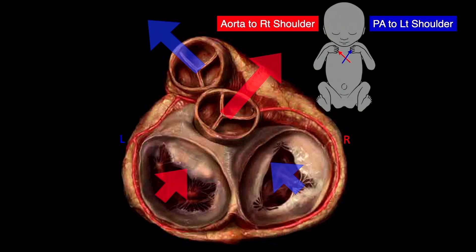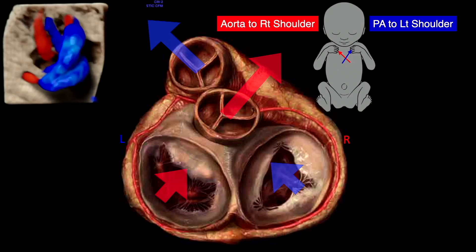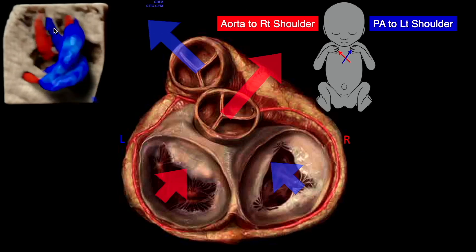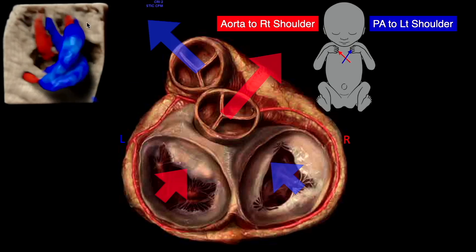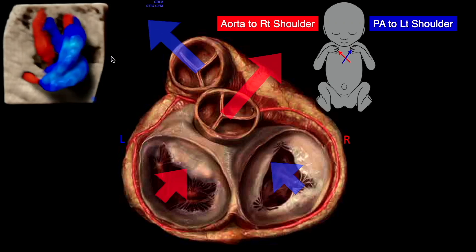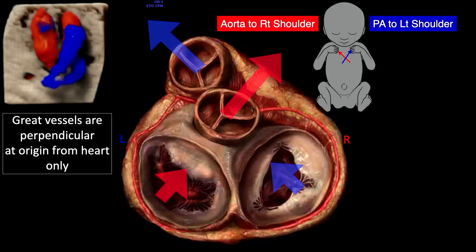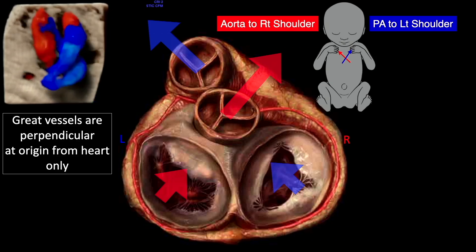That's really important. You see the orientation of the great vessels as they come out of the heart are perpendicular to each other. In this clip, the aorta is posterior to the pulmonary artery and is angling towards the fetal right shoulder. The pulmonary artery is anterior, angling towards the fetal left shoulder. The great vessels are perpendicular to each other at their origin from the heart.